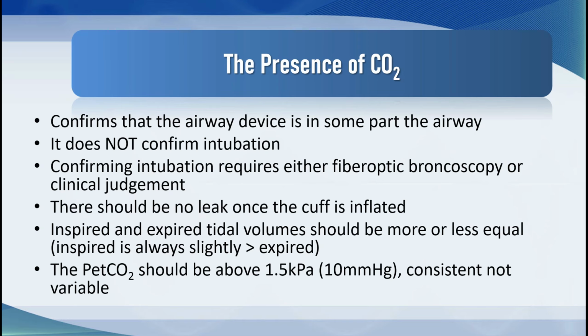Inspired tidal volume is always slightly greater than expired because the lungs take up a little bit more oxygen than they release CO2. The partial pressure of CO2 in expired gas, the end tidal CO2, should be above 1.5 kilopascals or 10 millimeters of mercury, and it should be consistent and not variable.